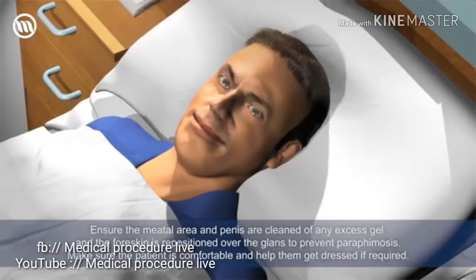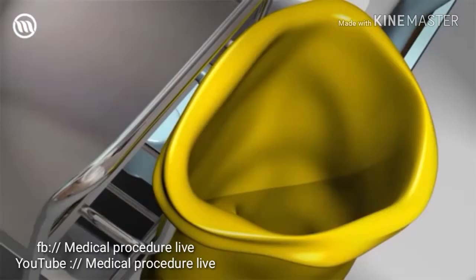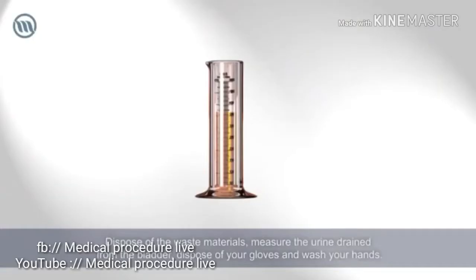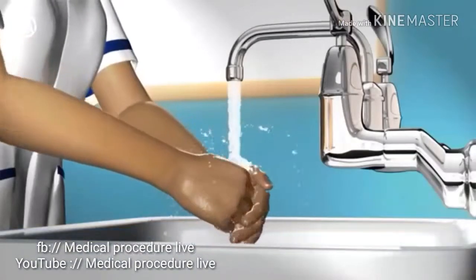Make sure the patient is comfortable and help them get dressed if required. Dispose of the waste materials. Measure the urine drained from the bladder. Dispose of your gloves and wash your hands.